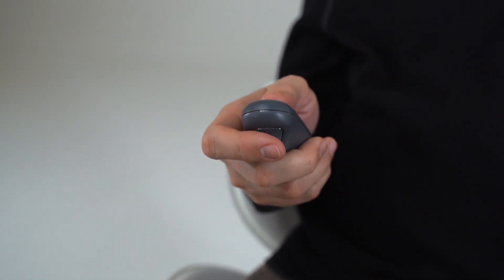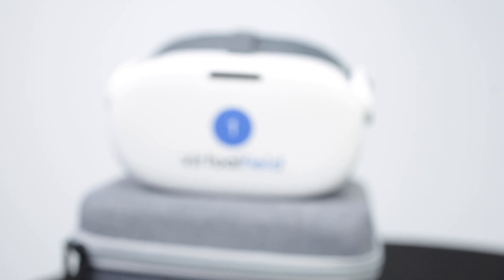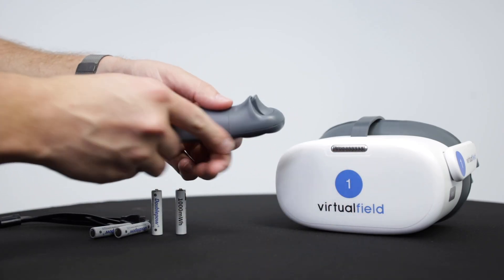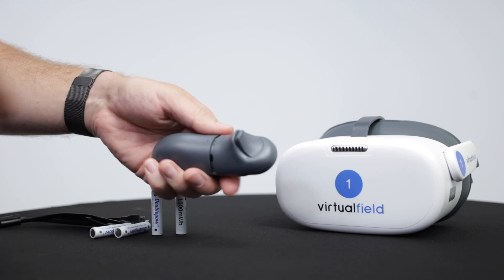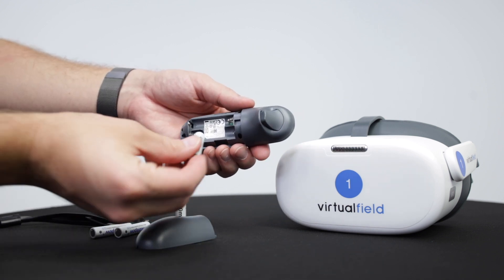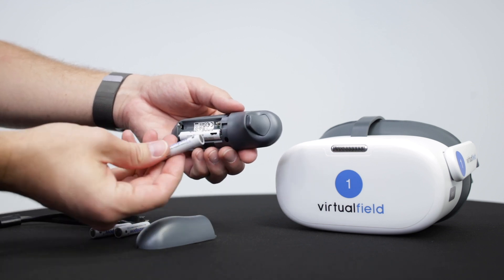The rechargeable controller batteries may die quickly, often after only a day or two of use. We recommend that you always keep two of the four batteries charging and replace them every morning before testing. Please review the battery section of our user manual for more information on rechargeable and alkaline batteries.